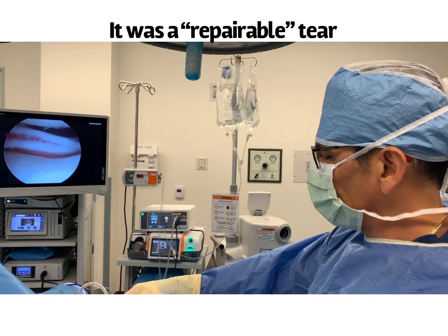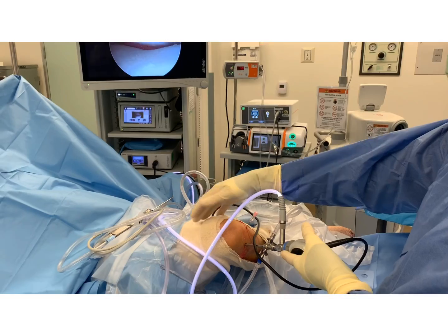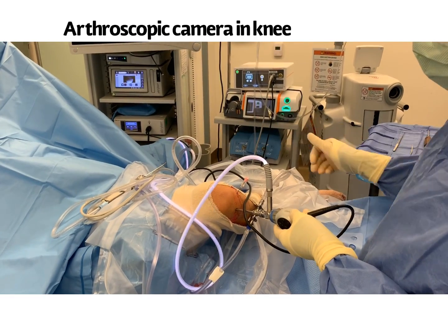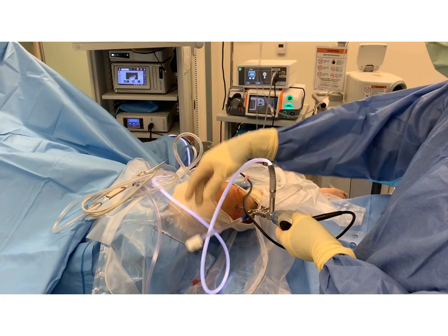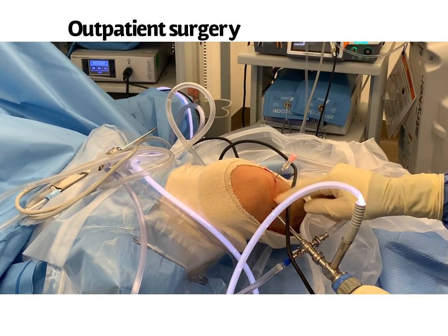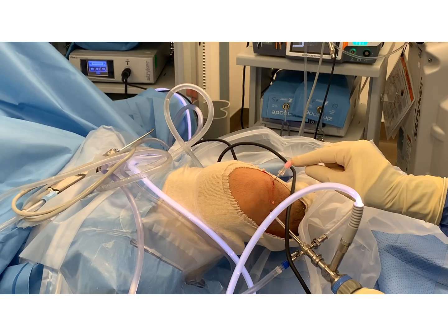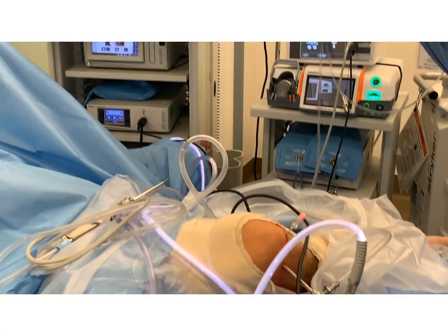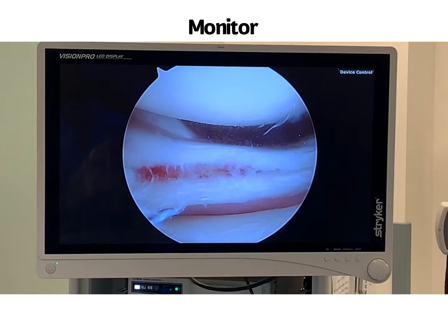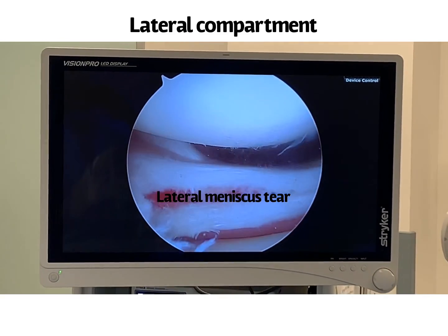The patient is now on the table and this is his right leg. We have the arthroscope, light source, water pumping into the knee, filling it up like an aquarium. On the medial portal I have a spinal needle, which I'll show you what I'm going to do with that in a second. Now we look at the screen — we have the lateral side of the knee, also known as the outer side of the knee.